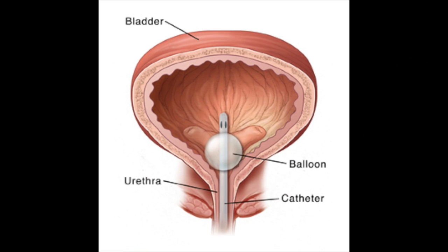In order to avoid intravesical looping and knotting of the catheter, which may require invasive retrieval, excessive catheter length should not be inserted into the bladder. In uncircumcised males, if the foreskin is retracted at catheterization, it should be repositioned over the glans immediately following catheterization in order to avoid secondary paraphimosis.